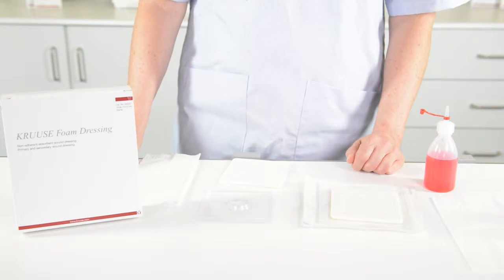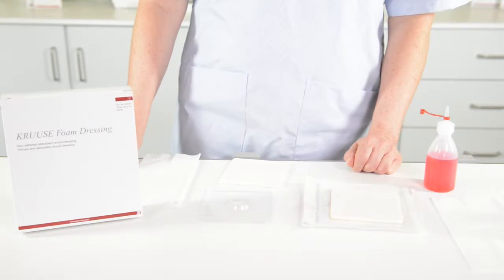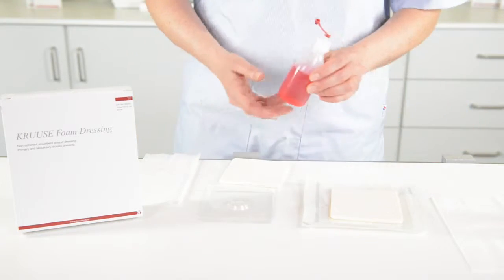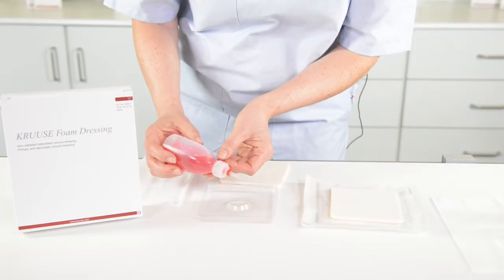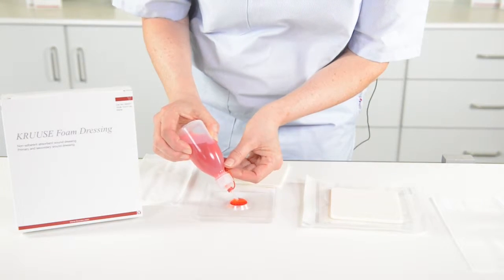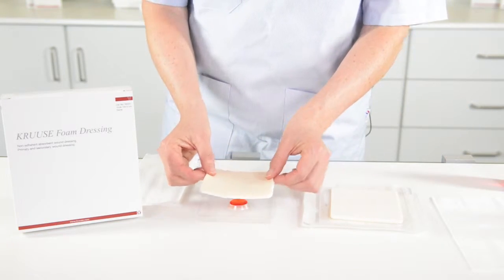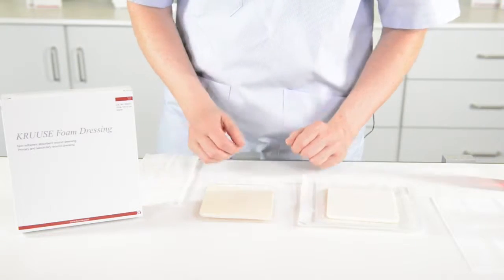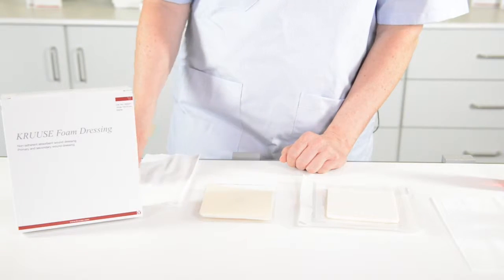This is a couple of ways to show the expansion of the foam and how the moisture gets into the foam and evaporates through the backing. This is artificial exudate. I will pour it on my small dish. So this is a wound with exudate — we put on the foam and it will immediately start to get into the wound.